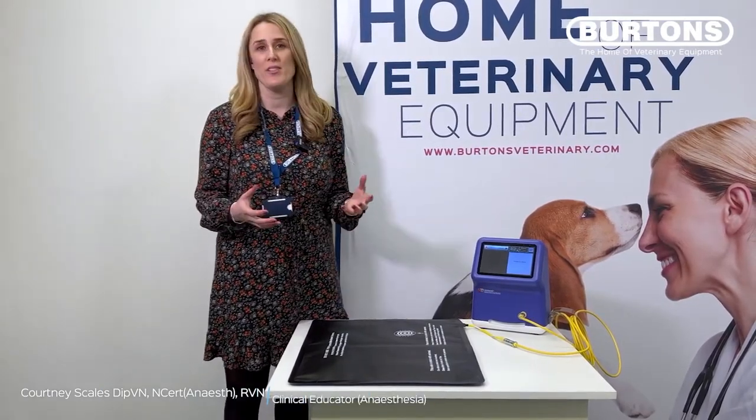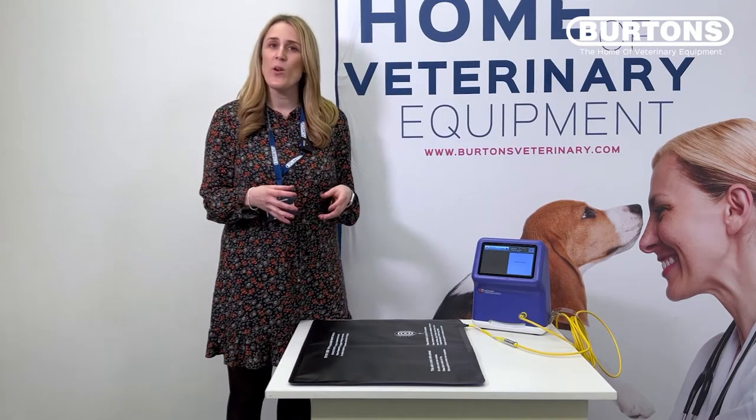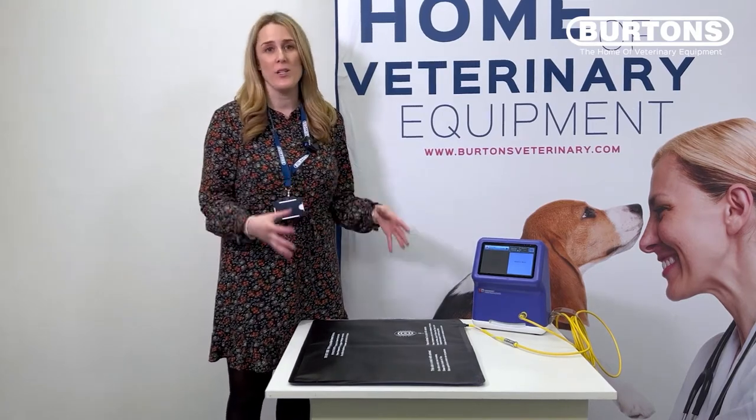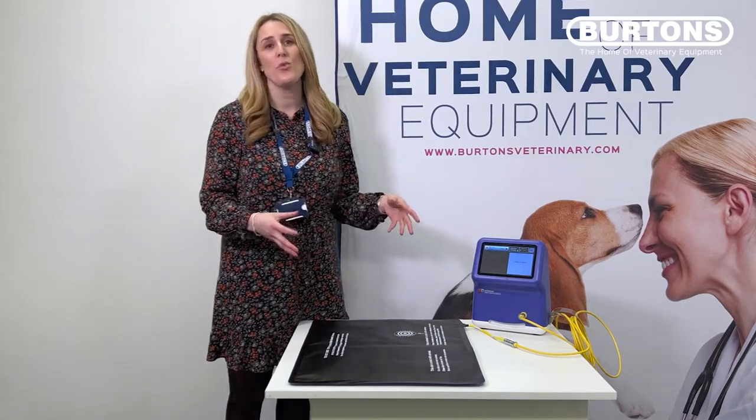Hi, I'm Courtney and I'm the Clinical Specialist in Anesthesia here at Burton's. Hypothermia is a really common complication in our patients that are under general anesthesia, and one way we can manage that is with active warming techniques. Let's take a look at the Hot Dog Veterinary Patient Warming System.